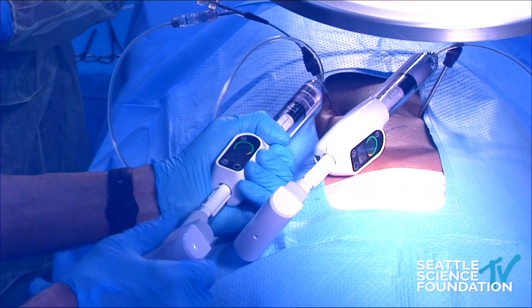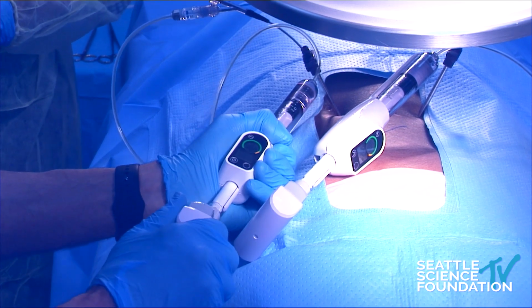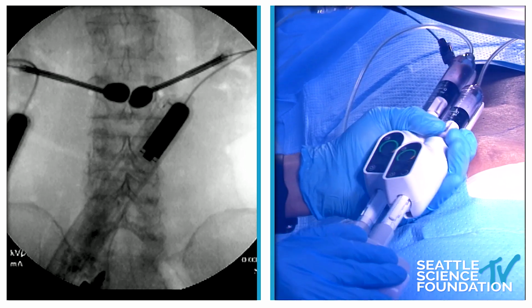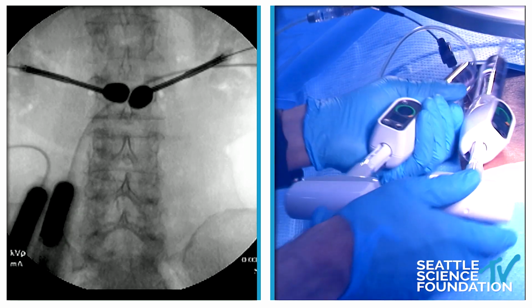We didn't check the AP view before I started doing this just for time's sake, but we knew because our trajectories were appropriate that we were right in there. And this is what's called the kissing balloon technique. I mean, the balloons are butting themselves up in the center, and you're able to get maximum balloon inflation.